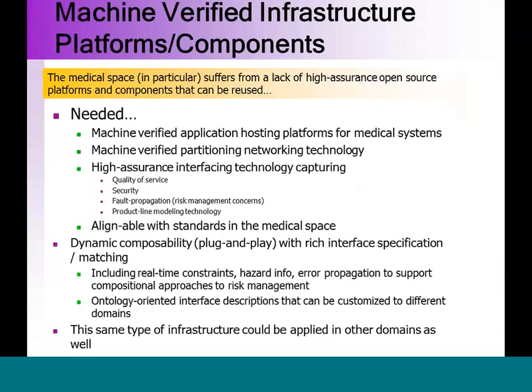I'm assuming that the work you're proposing scales up to the level of a hospital. Sure. Right. I assume that's sort of what you're doing. If you wanted to go beyond that to more of a regional or national level, the way the current ICE standard is specified, it's really one platform per patient. But you can imagine that being scaled up across an entire ward or something, with hierarchy developed to push information to the cloud.